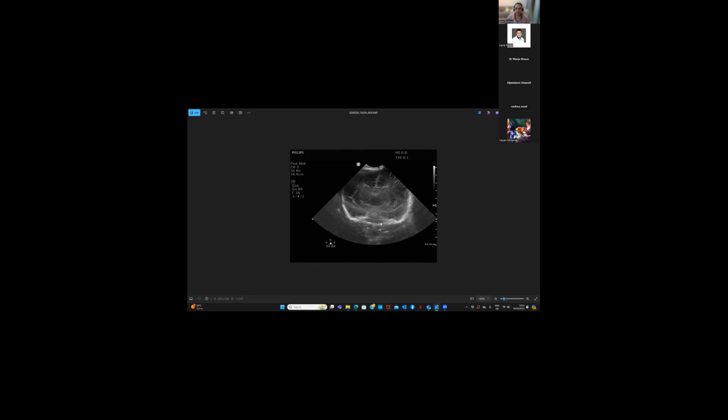It's a little bit blurred, and the reason is the baby was moving at that stage. Yeah, the baby was moving a little bit. What I'd say is, if the baby moves and you freeze an image, move the probe to try and get the best image quality. Well done. Carry on. And this is where we have reached the posterior-most, the occipital area now.